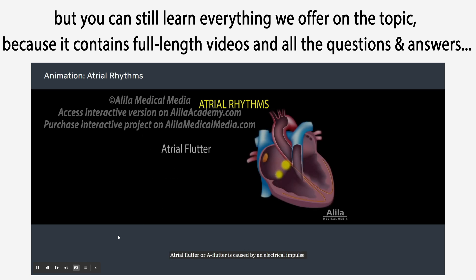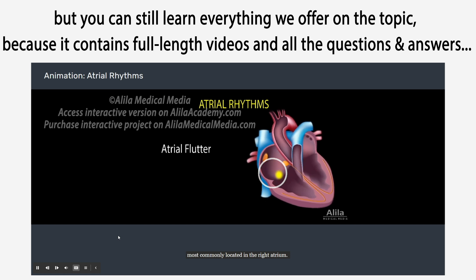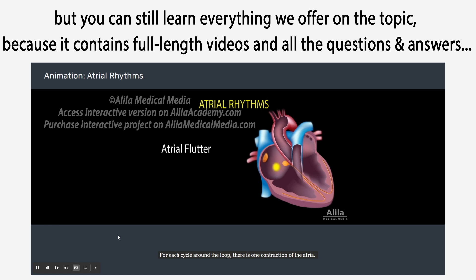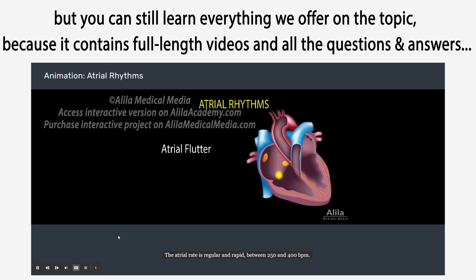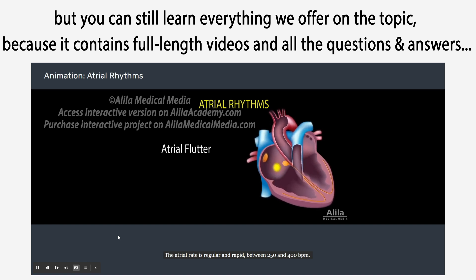Atrial flutter, or AFlutter, is caused by an electrical impulse that travels around in a localized, self-perpetuating loop, most commonly located in the right atrium. This is called a reentrant pathway. For each cycle around the loop, there is one contraction of the atria. The atrial rate is regular and rapid, between 250 and 400 beats per minute.